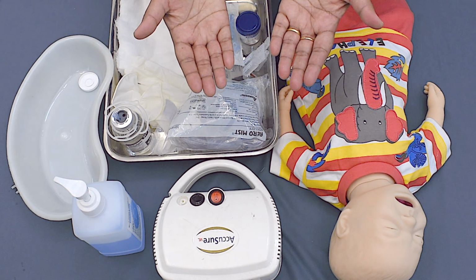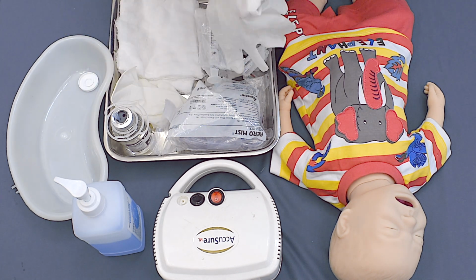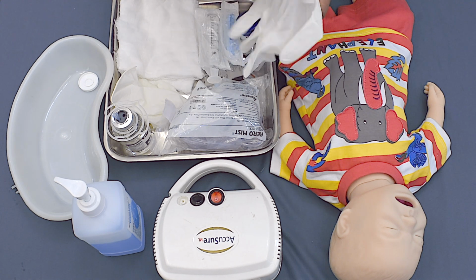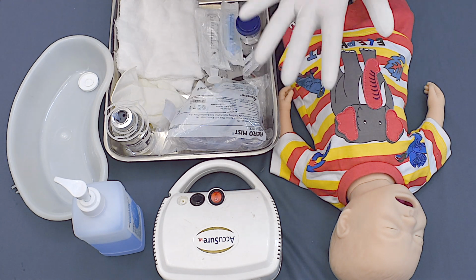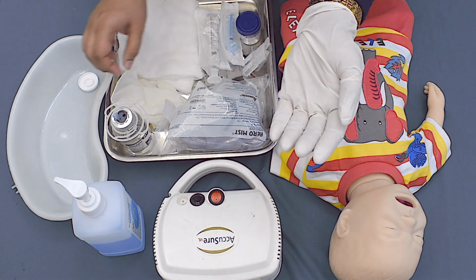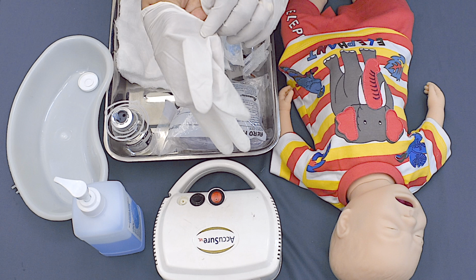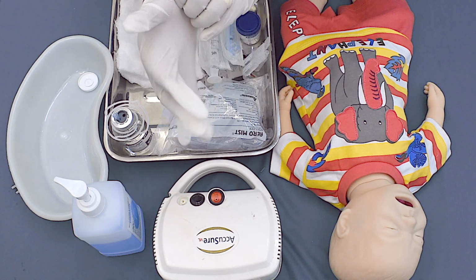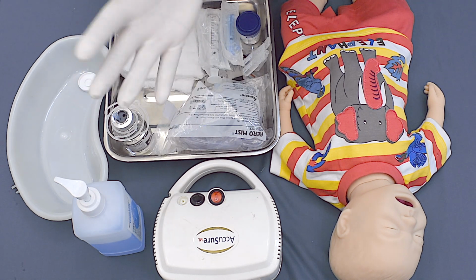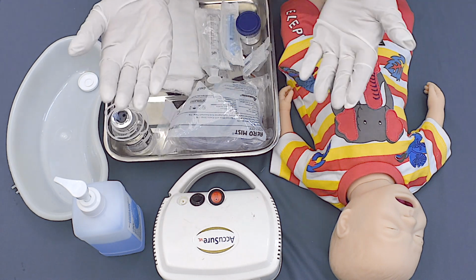Wash your hands first, wear clean gloves, now you are ready to perform the procedure.